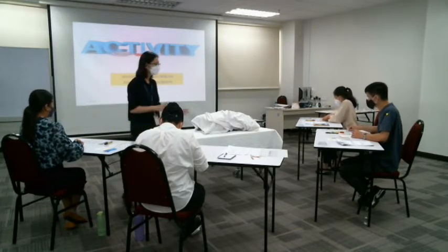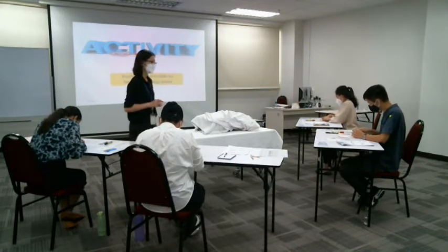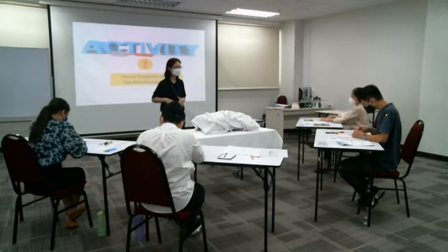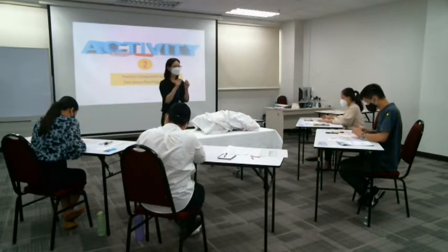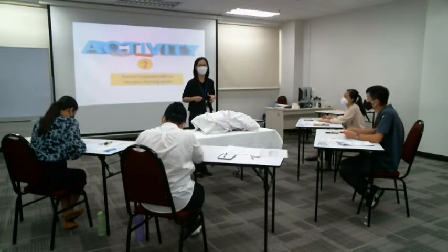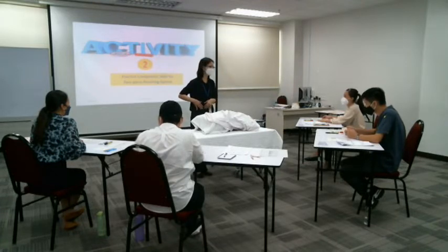Okay? All of you now able to fix it well and hear the click sound? Yes. Sometimes it's a little harder to fix it and hear the click, especially if the patient doesn't harden the abdomen. So when the abdomen is soft, then it's hard for you to press on it and to hear the click sound. So you may also tell the patient to bear down. So bearing down is like going to toilet. So when they do bearing down action, the abdomen automatically is harder. Okay?